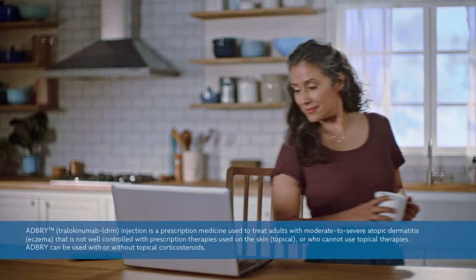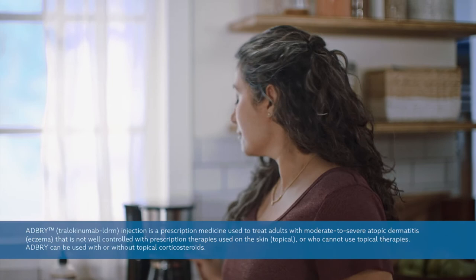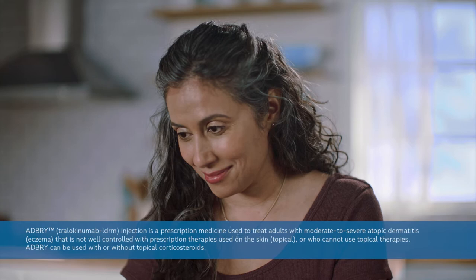Hi there, this is Emma. She's been living with atopic dermatitis, the most common type of eczema. Today, she'll be walking you through how to properly self-inject the two syringes that come in an ADBRI Tralokinumab carton. Even though you may have learned how to self-inject with your healthcare professional and practiced injecting with the training syringe in your welcome pack, your first time injecting at home might seem a little intimidating. Don't worry, Emma is here to help you get familiar and confident with the process.